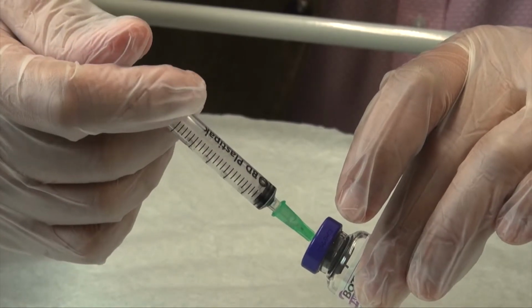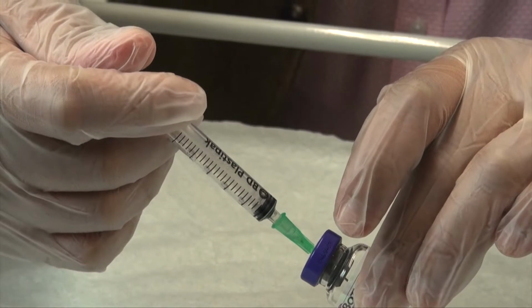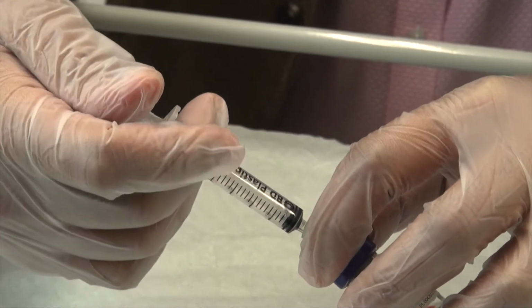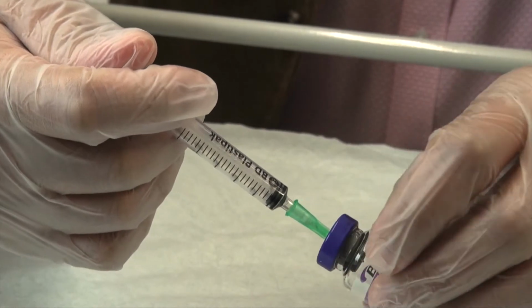So I keep my thumb pressed on the plunger. If I was to break the needle and the syringe now, Botox in solution would jet out against the wall, and we don't want that either.